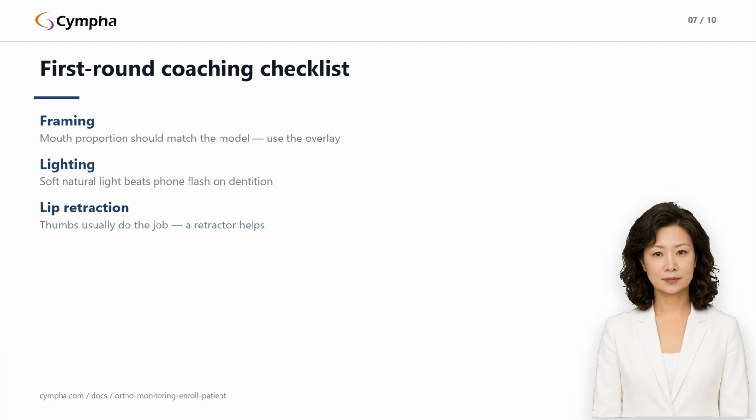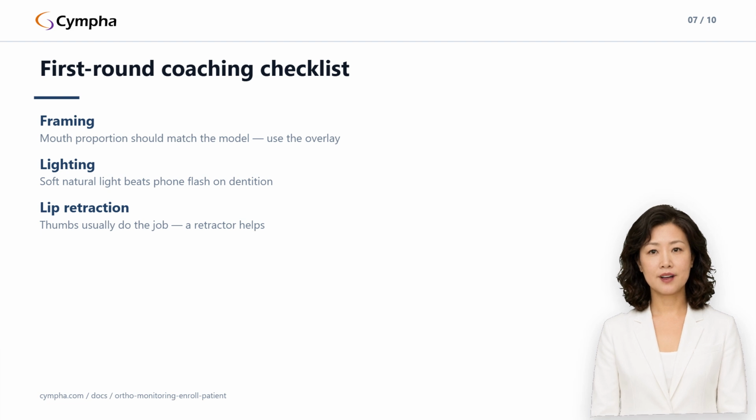Lighting. Phone camera flash on close-up dentition is harsh. Soft, natural light, or a bathroom mirror with overhead light works better. And lip retraction. If lips are hiding the buccal corridors, checking attachment seating and bracket position gets harder. A cheek retractor helps but isn't required, and most patients do fine with their thumbs.